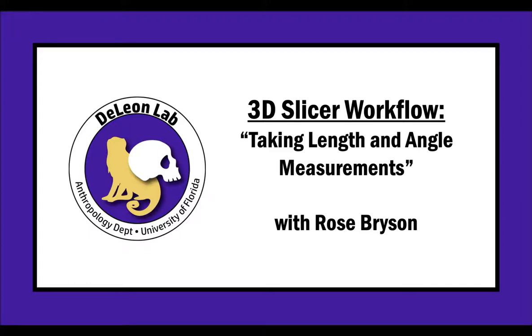Hi, this is Rose, and today's tutorial is going to cover how to take a length or angle measurement in Slicer.